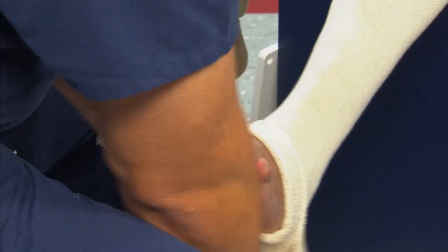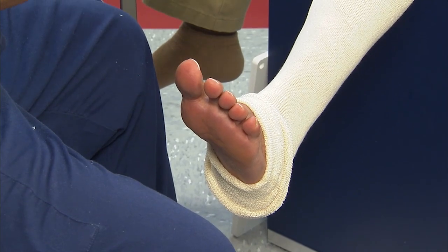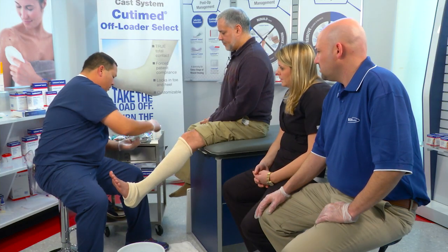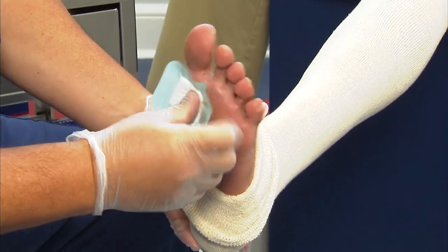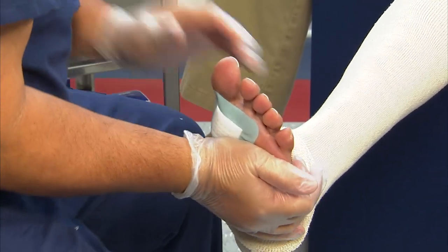Now I want to peel this back and I'm going to apply my dressing. I like the Siltec Soarback dressing — it is a bacterial binding material with a vertical absorption foam. I'll place that right over the site of the DFU, the simulated DFU.